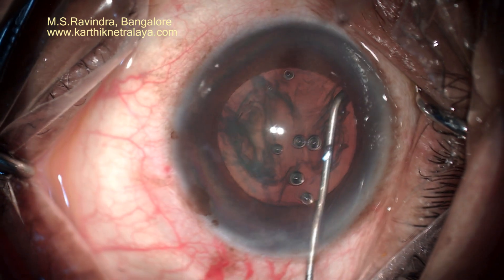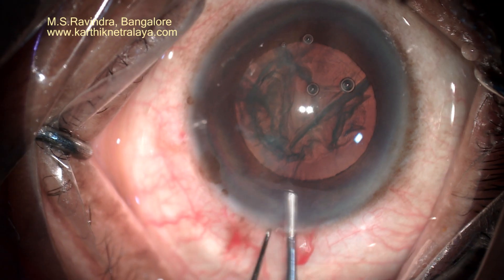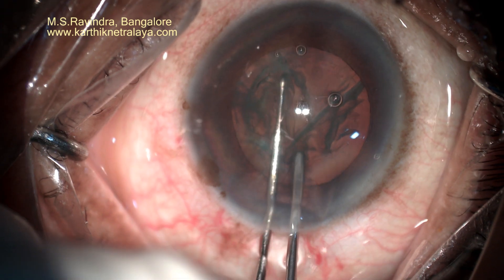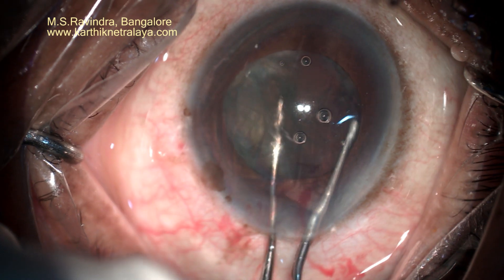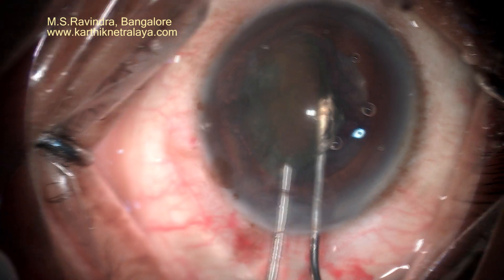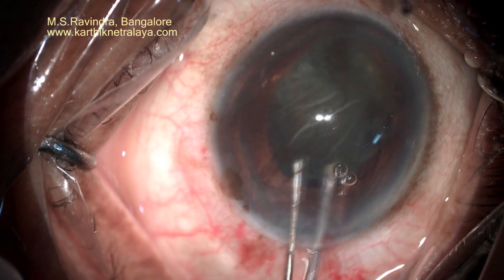I have been very careful because I know the zonules are weak and the capsule could get perforated or damaged. I rotate the nucleus very carefully and bimanually with two instruments — a Sinskey hook in my left hand.